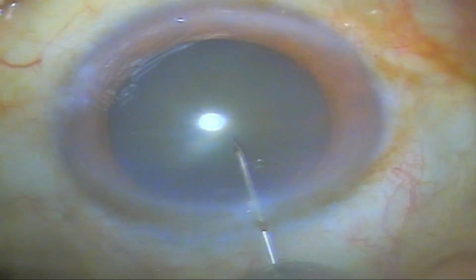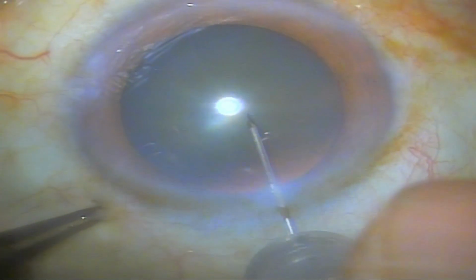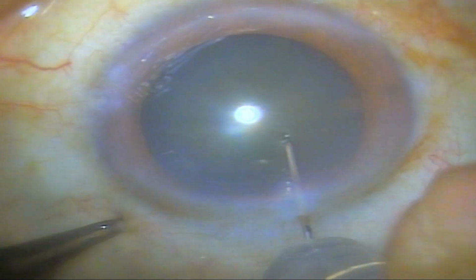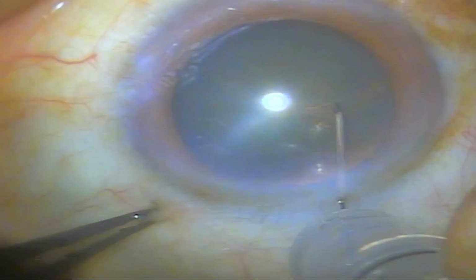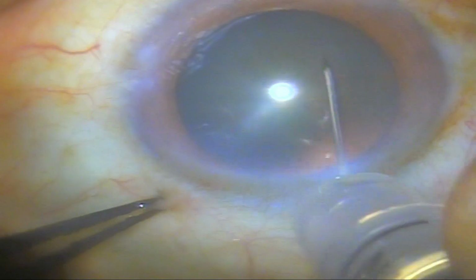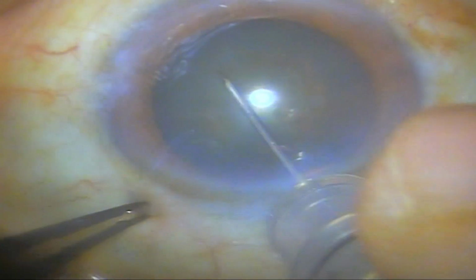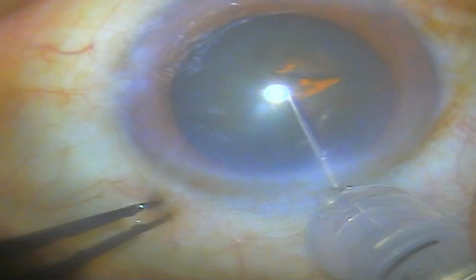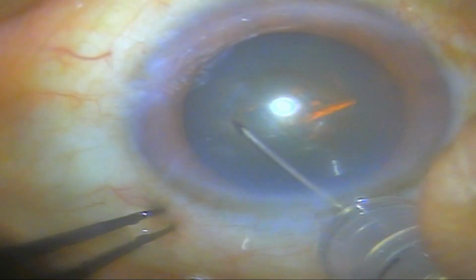Again, I will show you another case where we have got the entry through the gray line. We are using an insulin syringe needle as a cystotome, and in a formed and normal anterior chamber we are trying to create the round anterior capsulorrhexis.